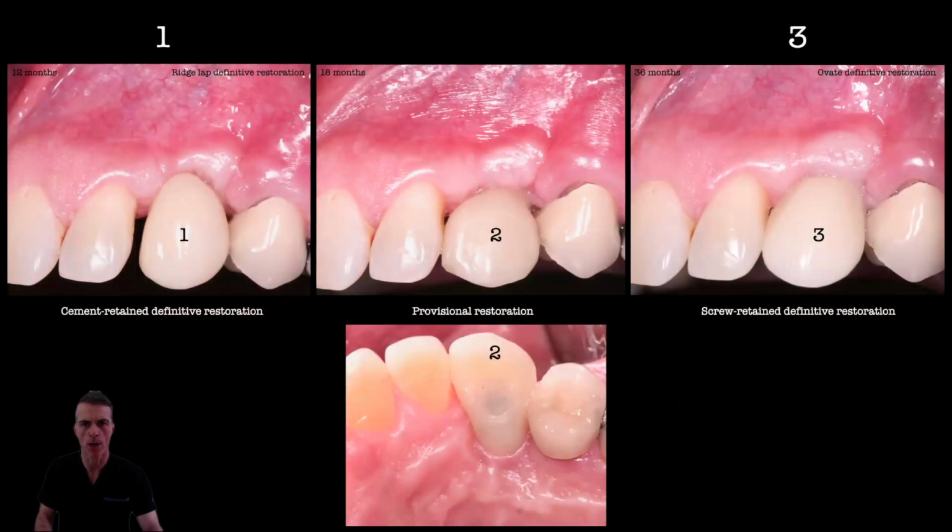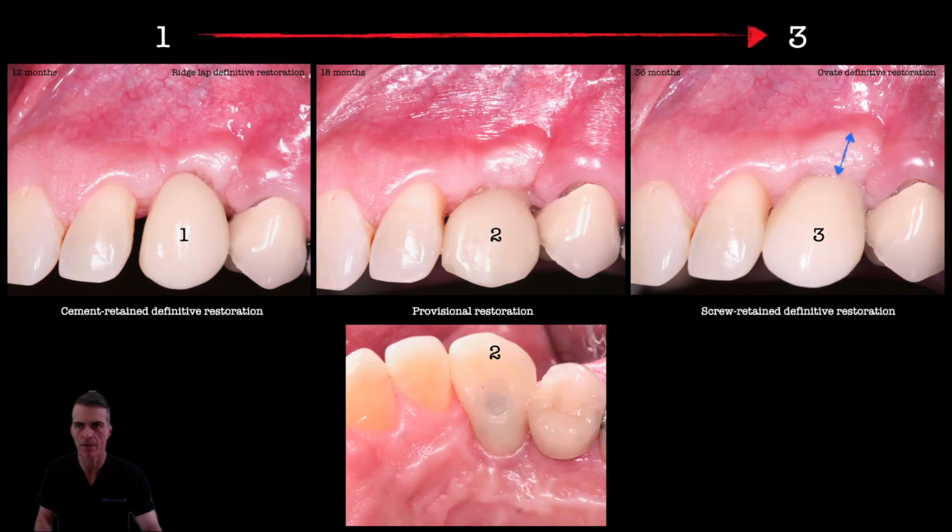And basically, I only do the surgical approach. I don't do any restorations, but we need to be watchful. As a surgeon, as a periodontal surgeon, I always like to bring the patients for follow-up and make sure that the implant-supporting restorations are healthy and are not putting any pressure on the augmented sites. This is one of the key aspects, and I believe that will make your cases successful long-term.